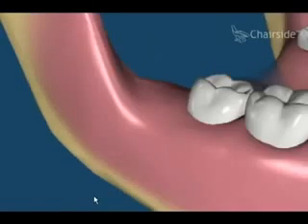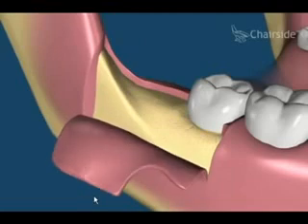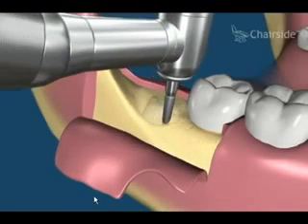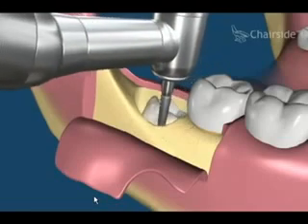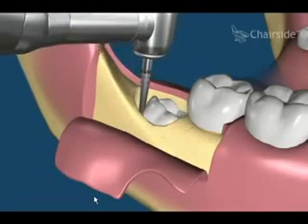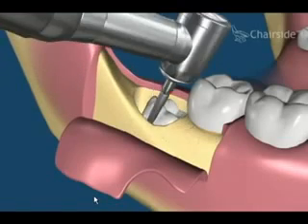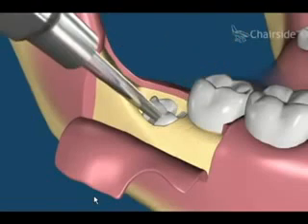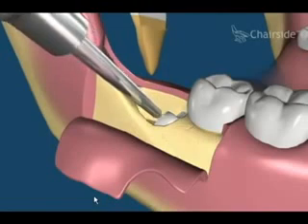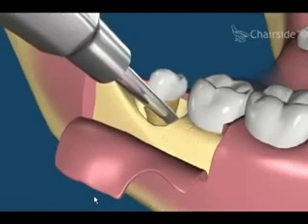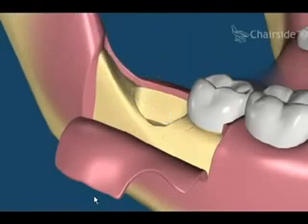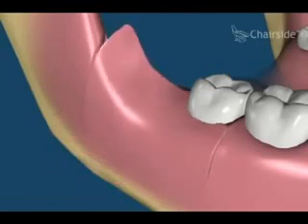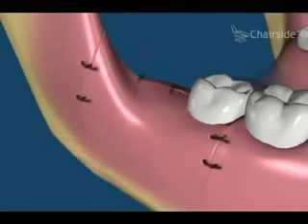This movie shows an impacted lower wisdom tooth. In a full bony removal situation, we first raise a flap. Since the tooth is completely covered with bone, significant bone is removed to gain access to the tooth, then we section the tooth. The tooth sections can then be removed with elevators. A bone substitute can be placed in the socket to aid in healing. The flap is repositioned and sutured into place, the sutures dissolve and the area heals.